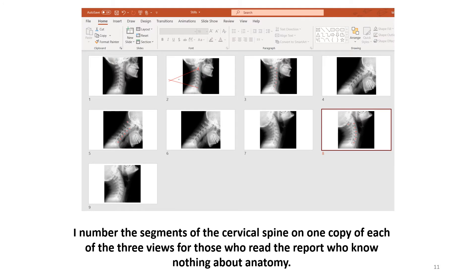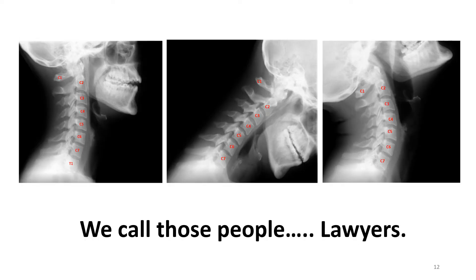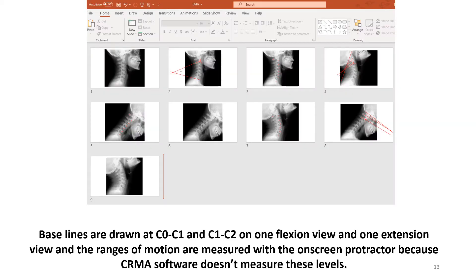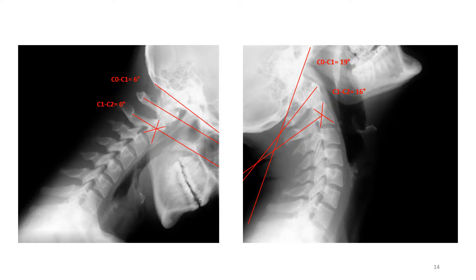I number the segments of the cervical spine on one copy of each of the three views for those who read the report who know nothing about anatomy — we call those people lawyers. I realize that mensuration programs like Posture Ray can do things like this, but until I get my own reading software, this is just what I have to do. Range of motion at occiput to C2 is very important, so I draw baselines on the occiput, atlas, and axis, and measure the angles in flexion and extension.